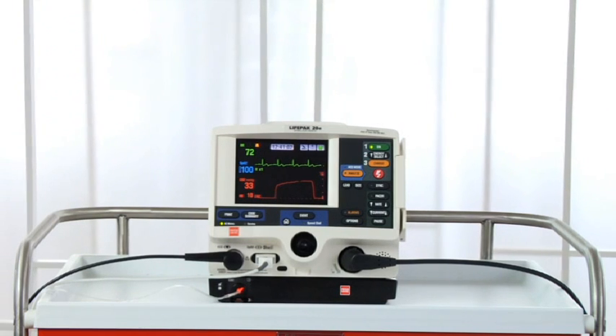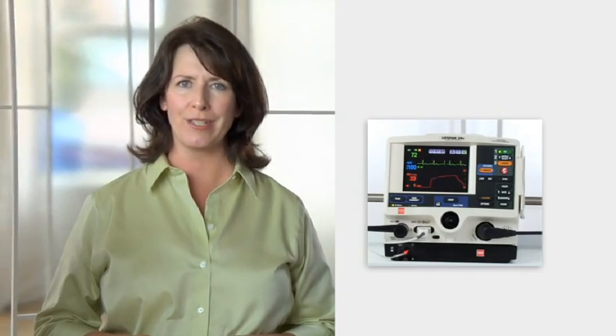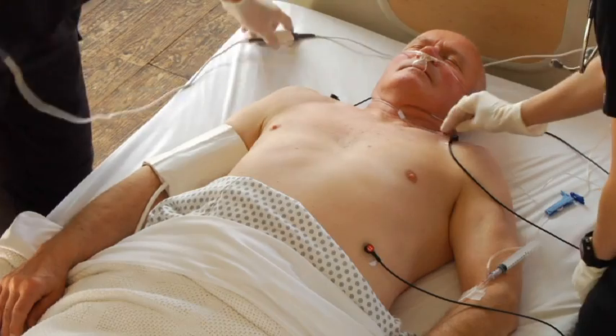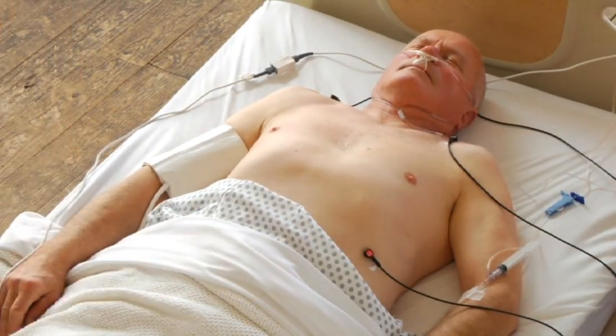The LifePak 20E Defibrillator Monitor can be used for either demand or non-demand pacing. Demand pacing is used for most patients, so that's what we'll show here. First of all, before you start pacing someone, always consider the need for patient analgesia or sedation.